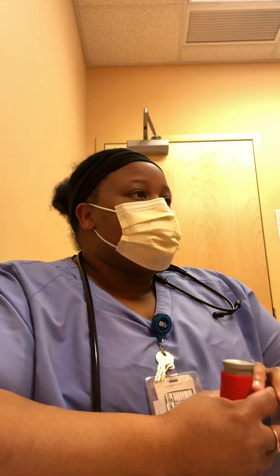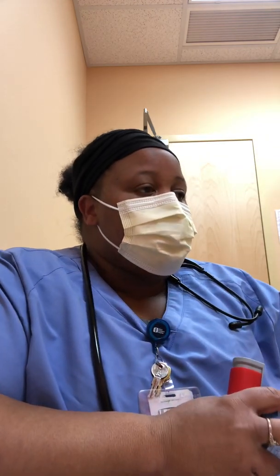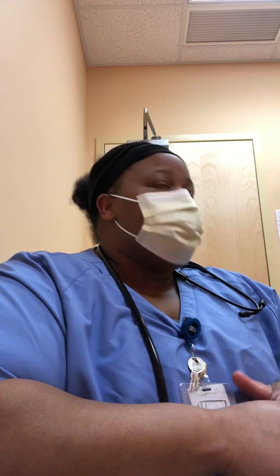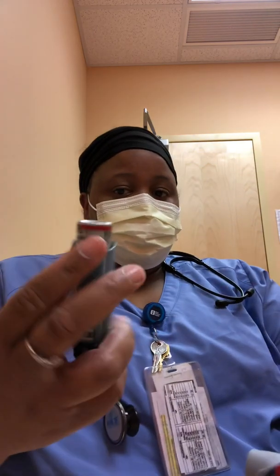So I always tell the patient, hey, the doctor talked to you about your inhaler that you're going to get today, or the breathing treatment that you took. We go over it because most of the time when they order the Flovent or the albuterol, depending on how bad the person's respiratory system is or how their lungs sound, they will kick it up with the order of a nebulizer treatment through albuterol. So I would bring in the machine, the Opti or Aero chamber as an example to show the patient, and some other inhalers.